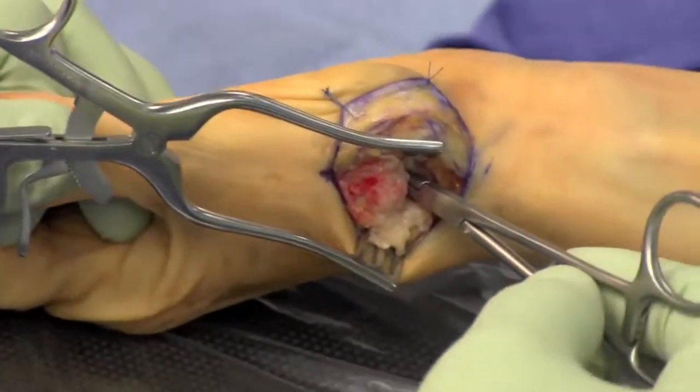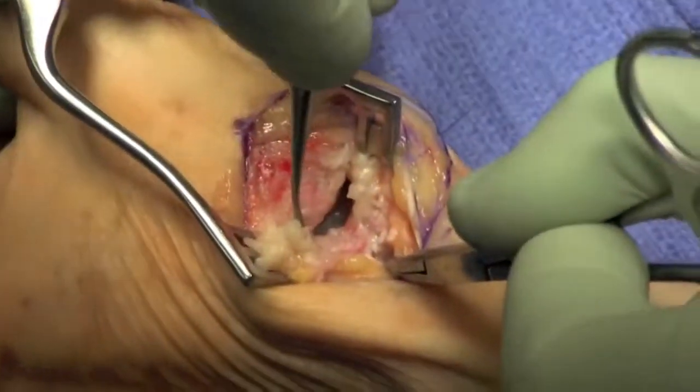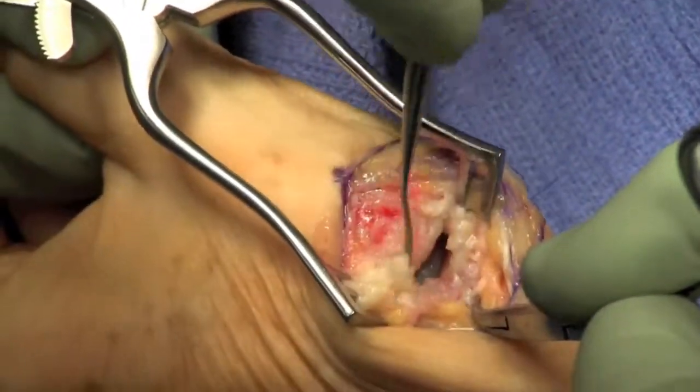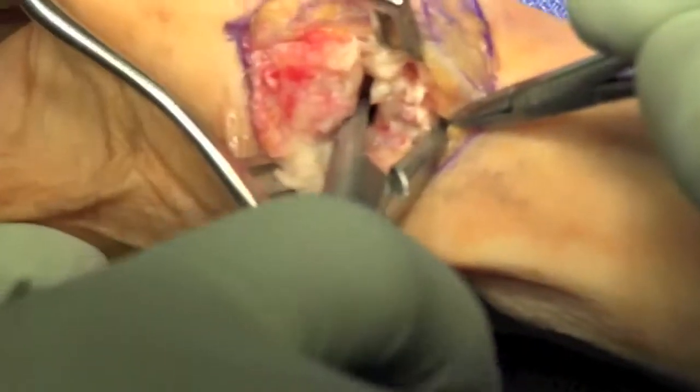We got a quick film to assure ourselves of position — it's not done routinely. The trapezium is then taken out piecemeal, sometimes using an osteotome, sometimes with a rongeur.